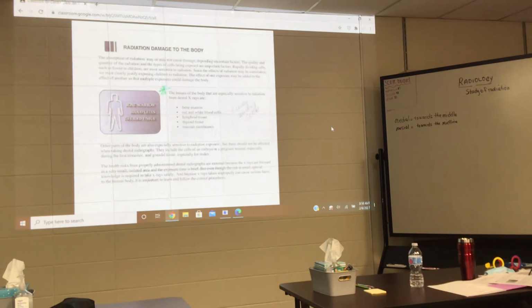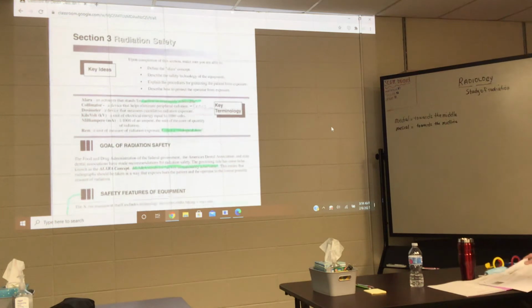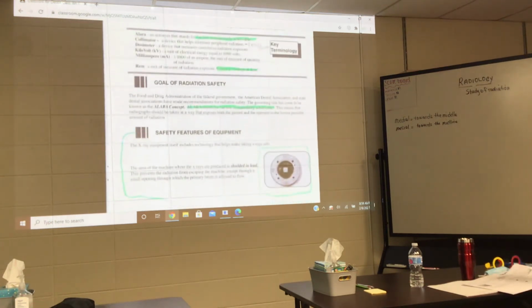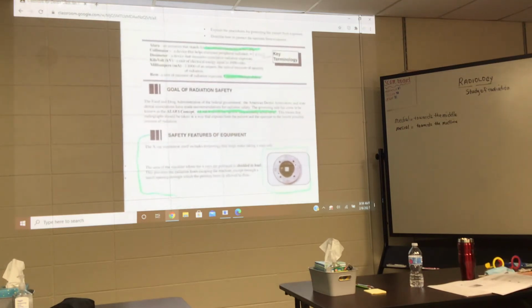Each time you are taking an x-ray on someone, you are exposing them to a dose of radiation, and you should take that seriously, okay? And you want to get the best result with the least amount of radiation, okay? All right, let's move on. But that is an important area, and I want you to especially pay attention to that asterisk area.